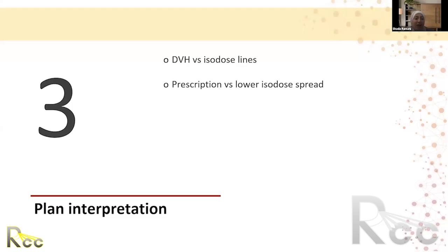And I see the last one: absolute doses. Absolutely. I always look at absolute doses. I never look at relative doses, whether in the DVH or in the plan itself, because looking at relative doses one time created a large safety issue for a patient when we started 3D planning. So now let me share screen.